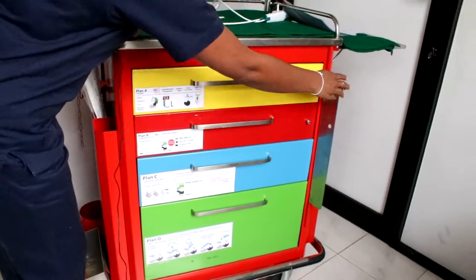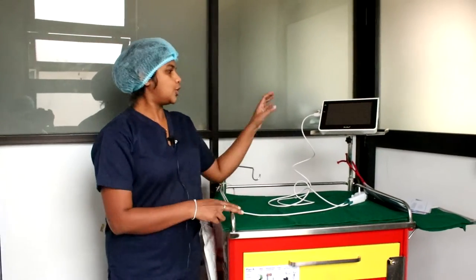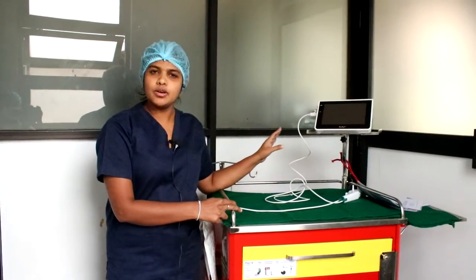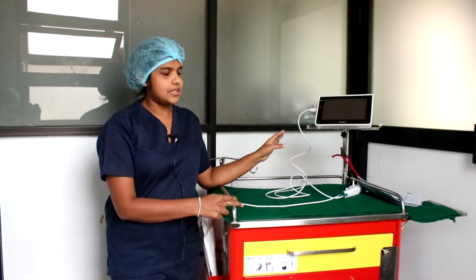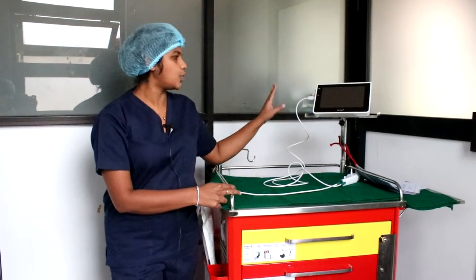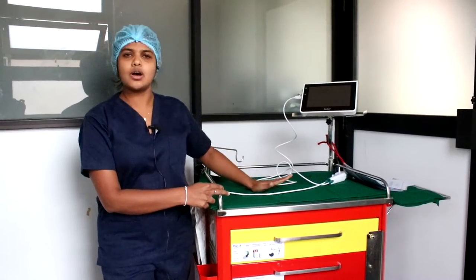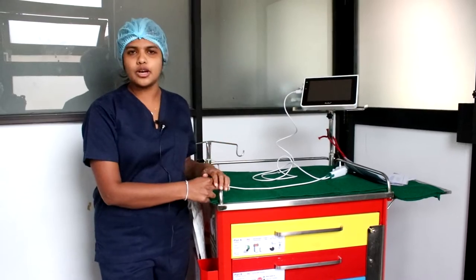This trolley also facilitates the use of equipment needed for fiber optic intubation. If you have planned for a fiber optic intubation, you can store the monitor here and assemble your equipment on the top of the trolley.